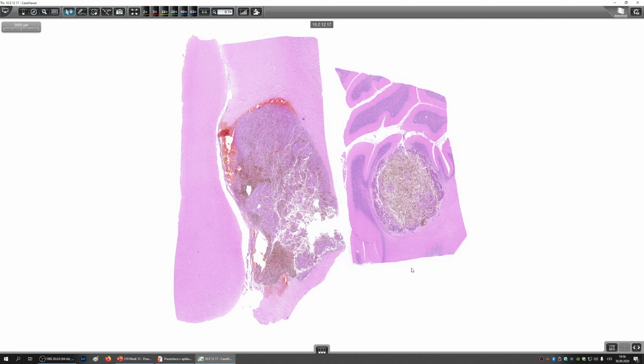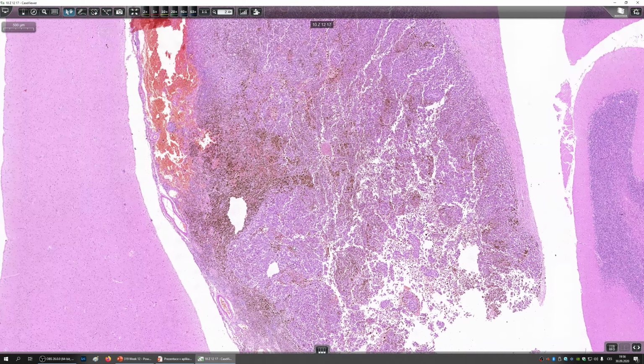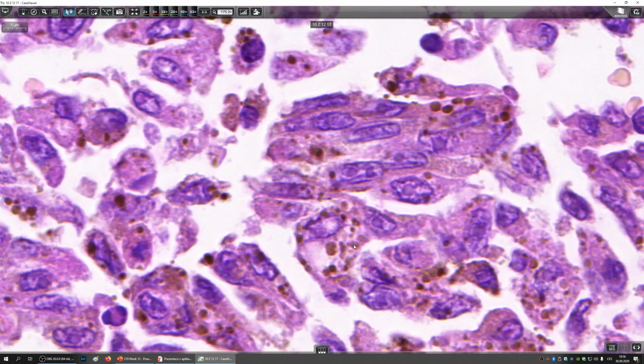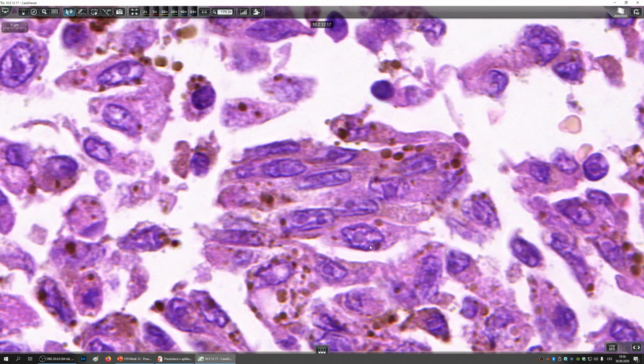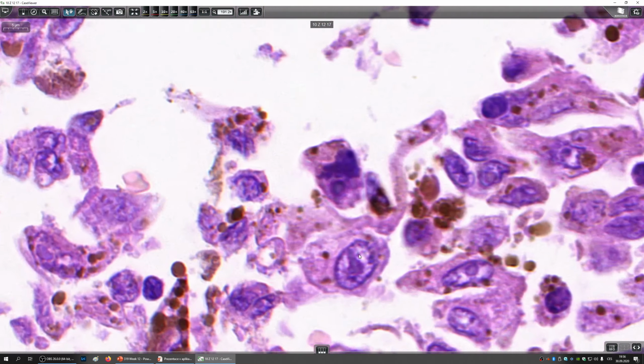Here we have the cerebellum, and here we have just the cortex. So this is a sulcus. So this has metastasized to the cortex. And this also has metastasized to the cortex of the cerebellum. Let's go closer. Big ugly cells, mostly spindle-shaped, with a typical nucleus for melanoma. So melanoma usually has a vesicular chromatin and a big nucleolus, as you can see here. So this is the typical look of melanoma. This cell is very typical.